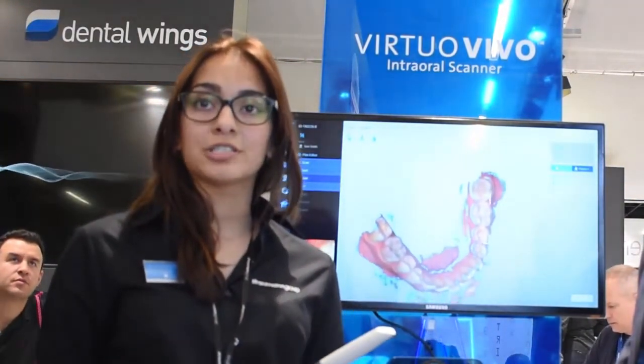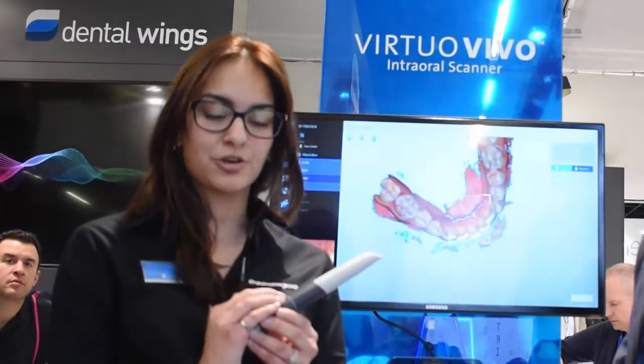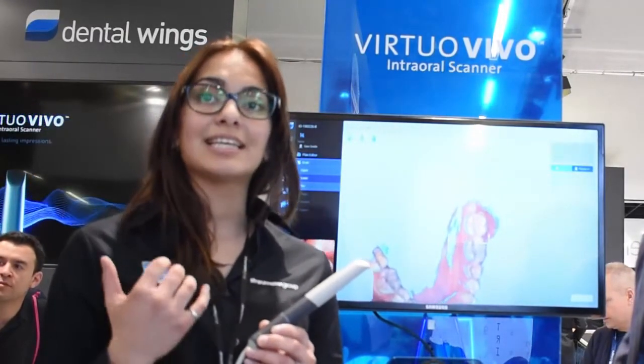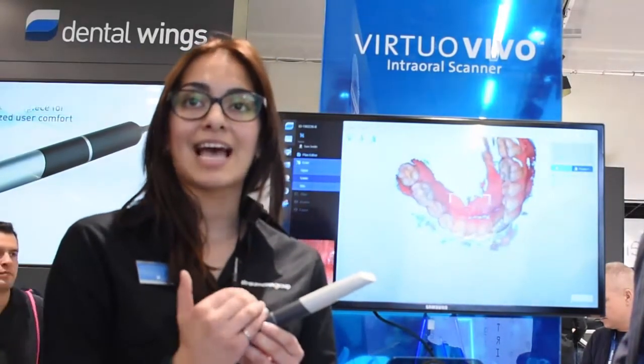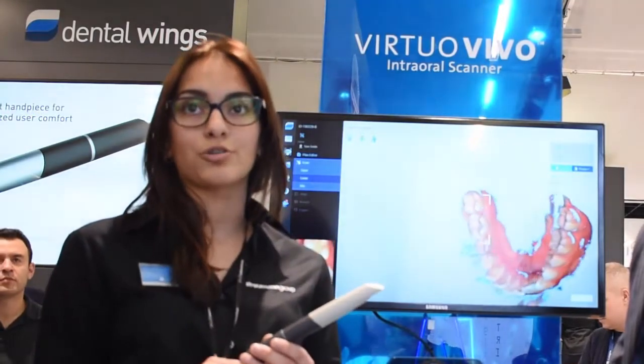We are doing colour scanning, and what's also important is that we have an indicator light right here, which means that the dentist can focus solely on the patient. So when this ring is green, it means that scan data is being acquired. When it's red, it signifies that you're no longer scanning.